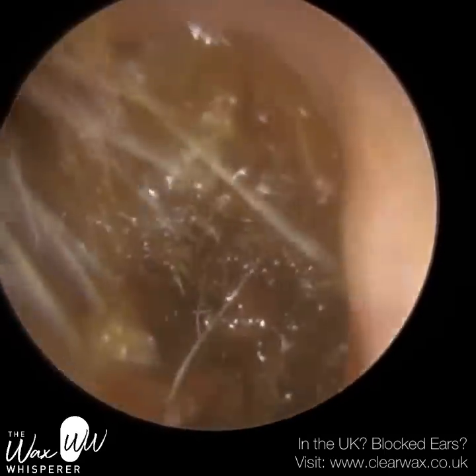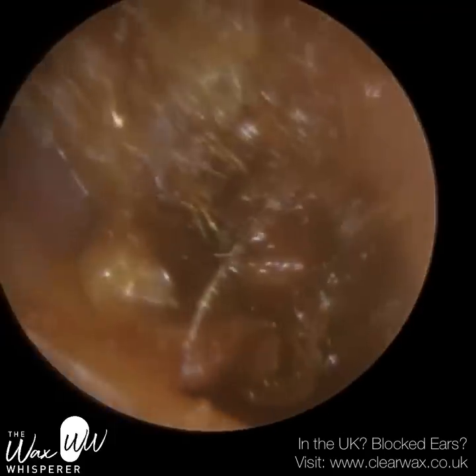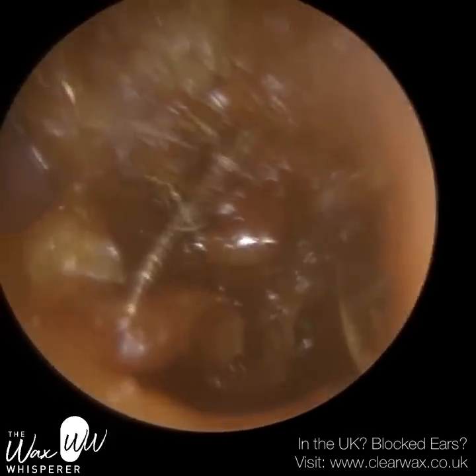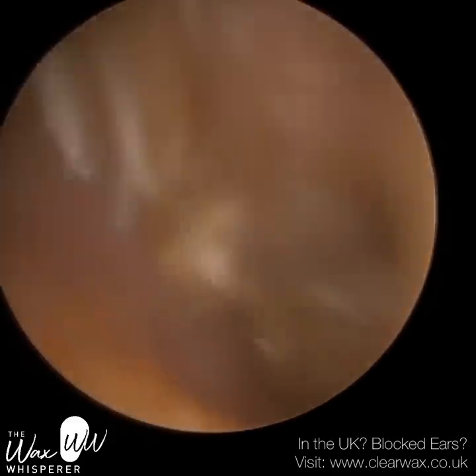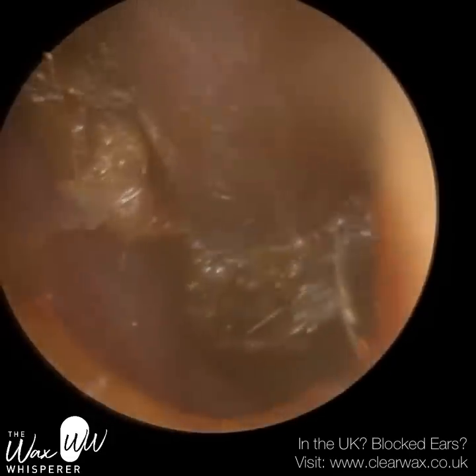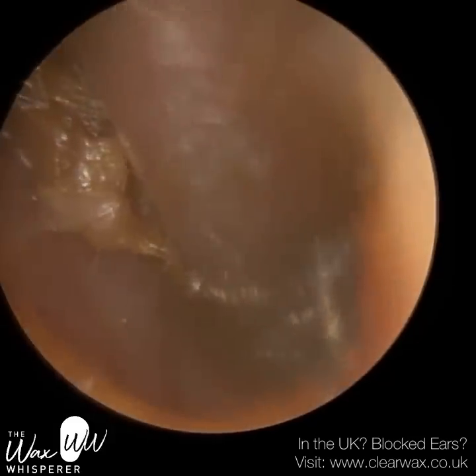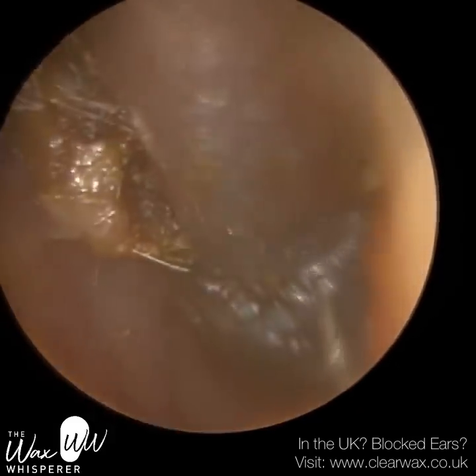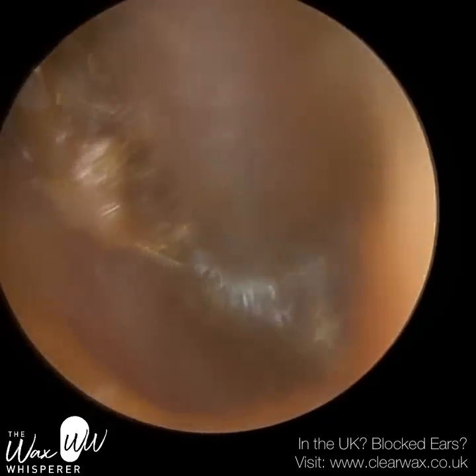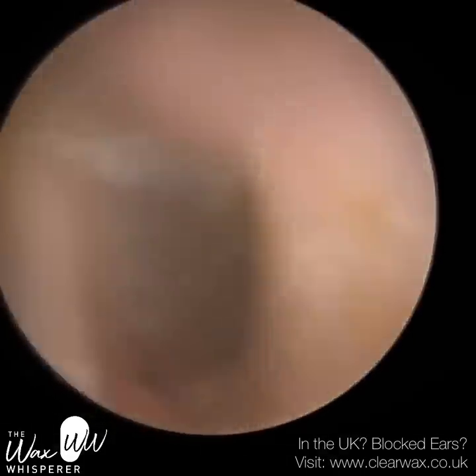It just got a bit blurry, so I came away with the suction probe and I'm going to re-enter the ear. Just by loosening the wax, the patient did notice an improvement in their hearing, because this plug was completely occluding the ear canal. There was no sound or air managing to get through the sides of the plug — a complete airtight and soundtight seal. Just by breaking that seal, patients can notice an improvement.